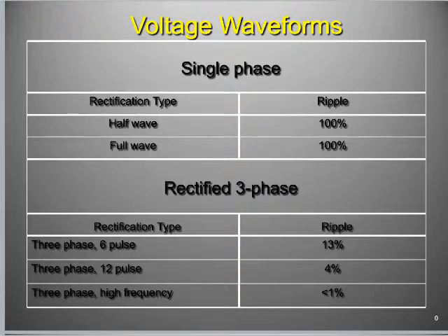Well, where do we use an engine or a motor, right? We use it to spin the anode. So in this case, we have a stator, a wire coil that's just staying there, and it's pulsing power at a rotor which is rotating now, right? So that's an example of a motor. So we've got them right next to each other on page 125.